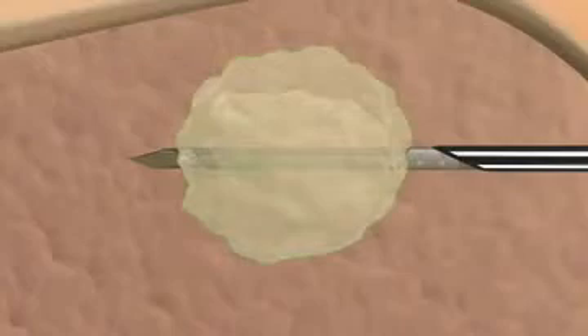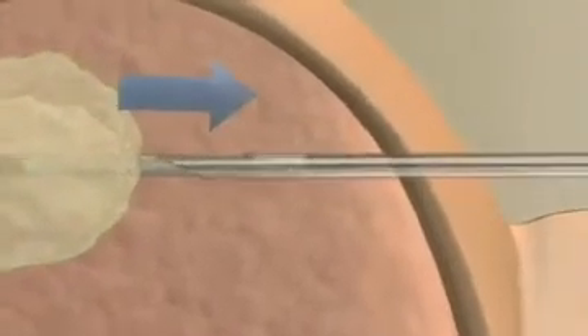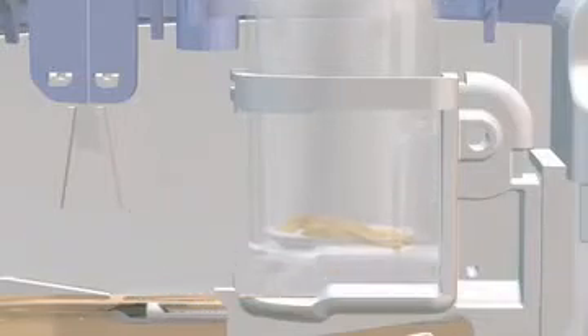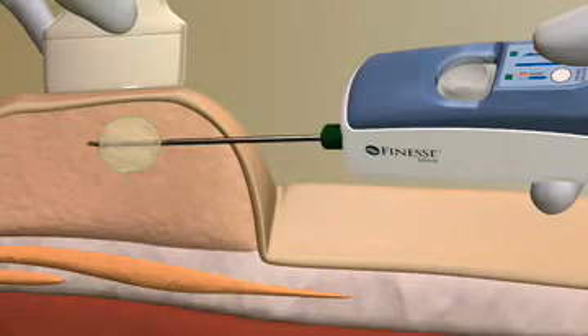During this process, the vacuum turns on, tissue is drawn into the sample notch and transported into the sample container. The system resets for the next sampling sequence. You can reposition the probe and capture additional tissue samples by pressing the sample button again, without removing and inserting the probe.